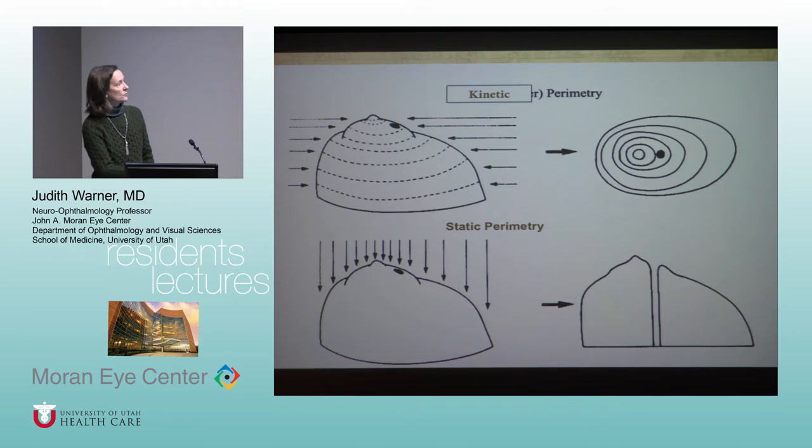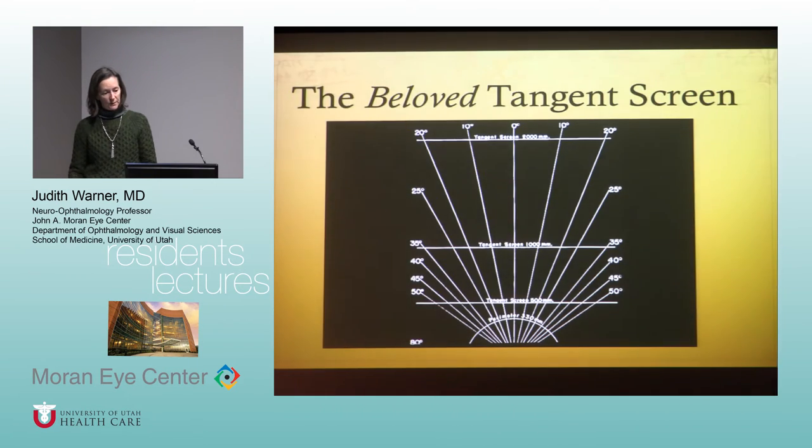Here is, of course, the physiologic blind spot. It's an absolute scotoma. There's no retina there, therefore there's no vision.